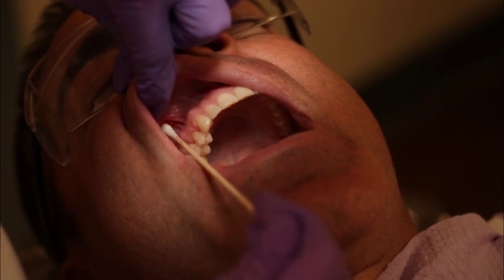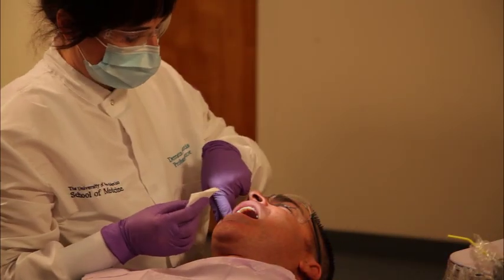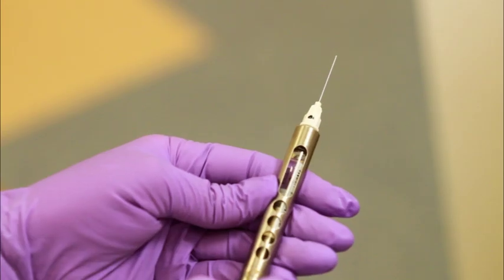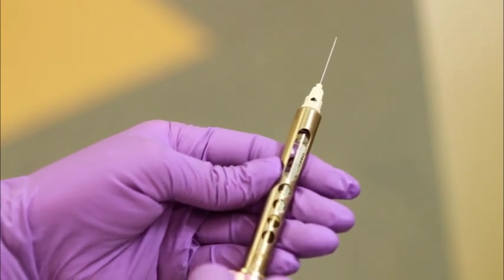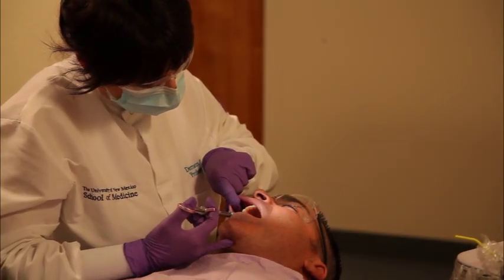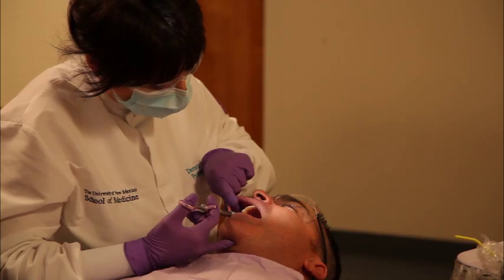Topical anesthetics are most effective for patient comfort when applied for 1 to 2 minutes. Dry the tissue to remove excess topical anesthesia. Using a 27-gauge short needle in the syringe in the dominant hand, orient the bevel of the needle away from the large window of the syringe to ensure that the bevel orientation is toward the bone. Establish a fulcrum that allows you the greatest stability of the syringe. Place the syringe parallel with the long axis of the tooth, with the large window facing you.